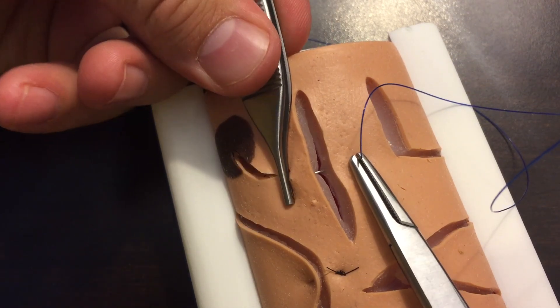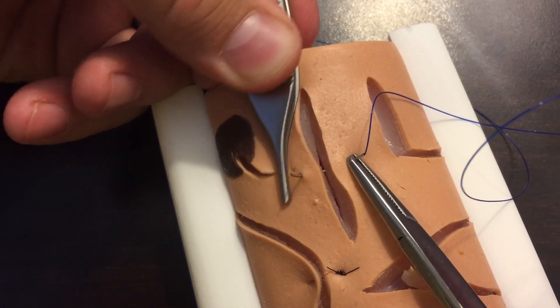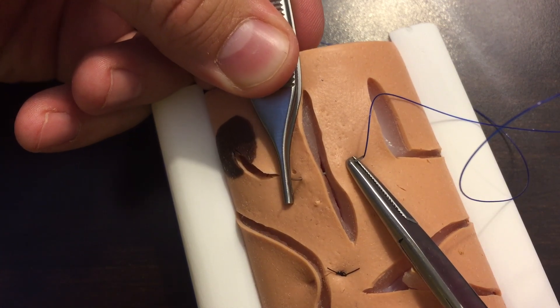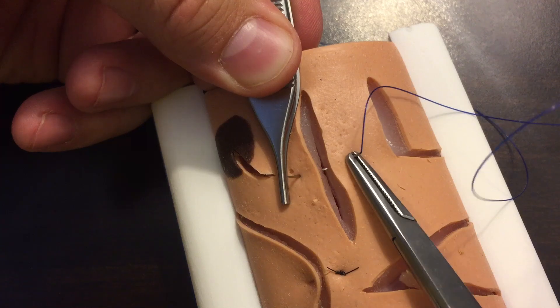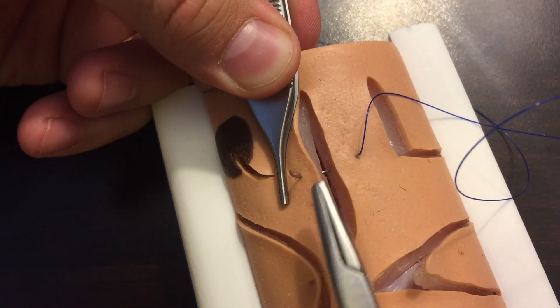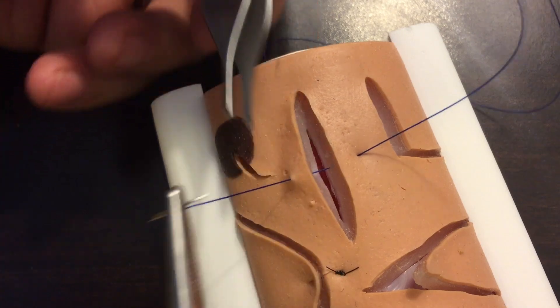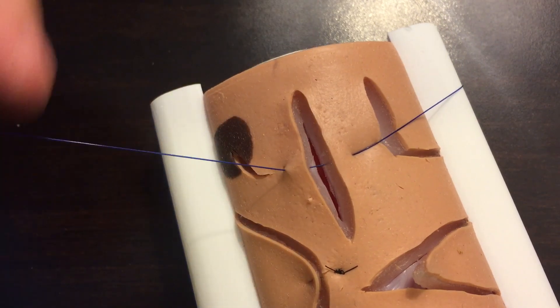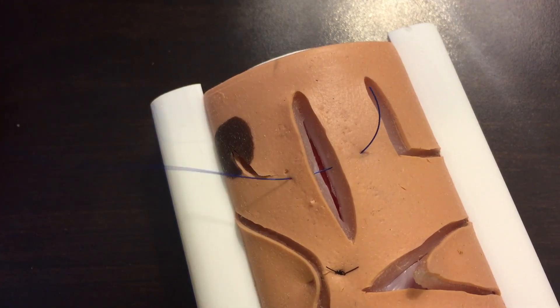Then you're going to exit the skin at 90 degrees. I like to put my pickup like this and push down on the skin, which helps the needle exit the skin at 90 degrees. This is going to help with the eversion of the skin edges. You pull it through like this.